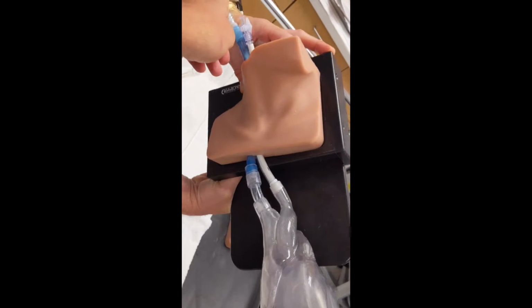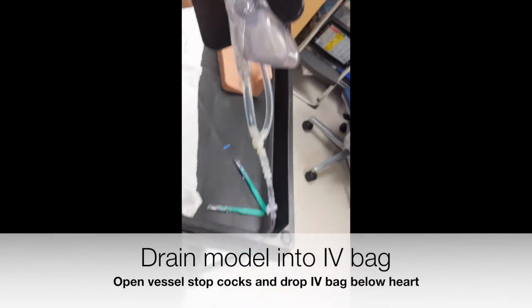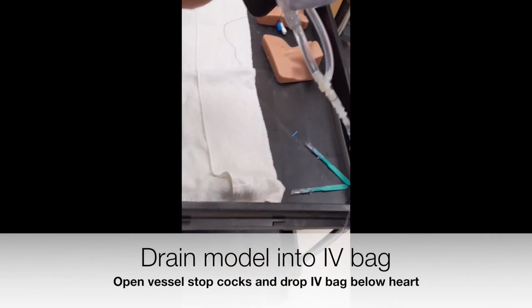So to drain it, we open the stopcocks, put the bag down, and reverse drains.